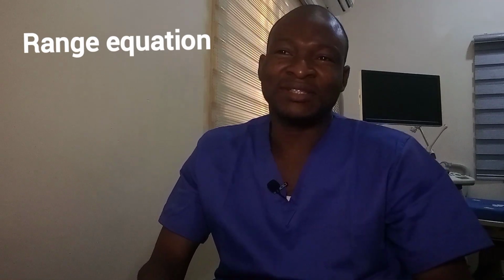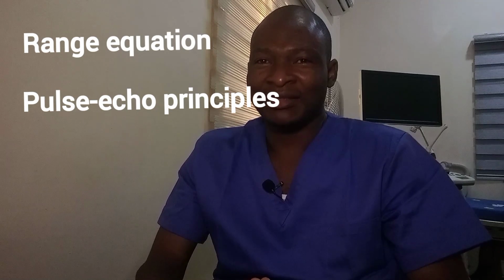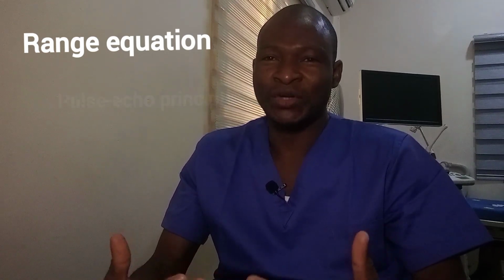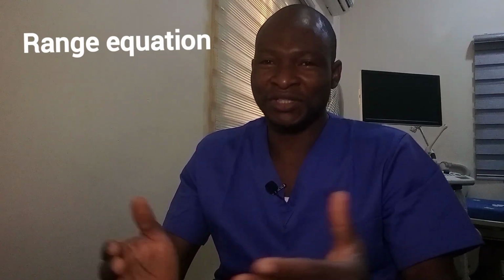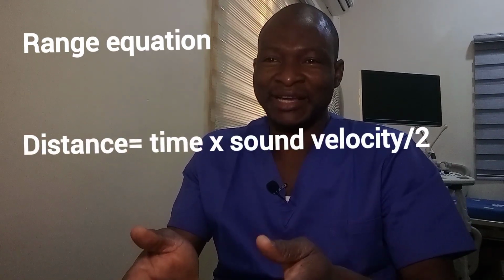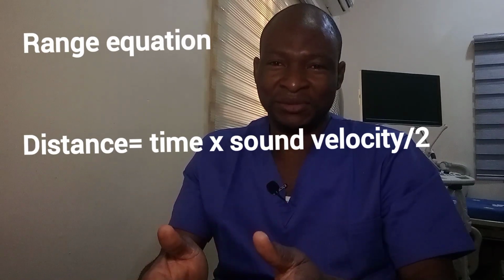So, range equation, what is it all about? You see, the ultrasound system operates on the pulse echo principle, and to calculate the depth of each echo or depth of each reflector, the system uses the range equation. And of course, the range equation is distance equals time times velocity of sound divided by 2.